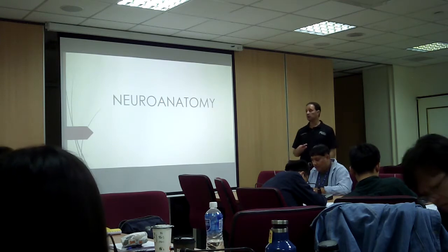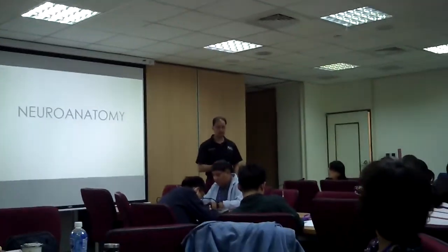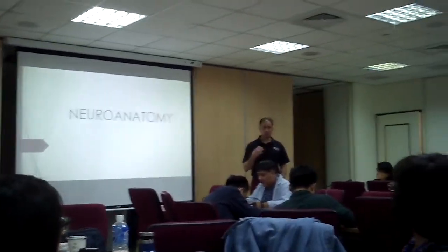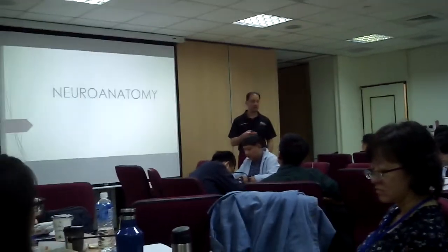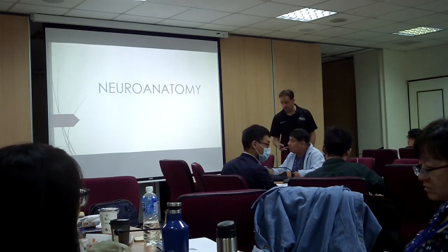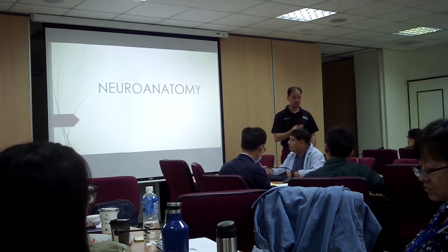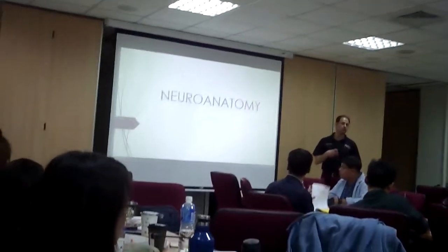So now, the other thing we need to know is what part of the brain does what. So for you to have a good assessment, it's very important to know what are the functions of those areas of the brain, and depending on what the brainwave is presenting, and the morphology of the brainwave, and the pattern of the brainwave, then you can have a better idea of what to suspect and how to intervene.